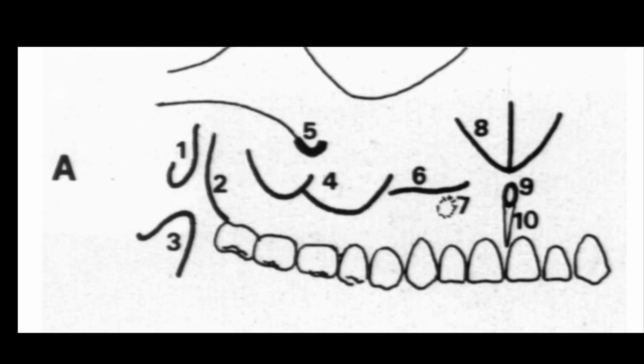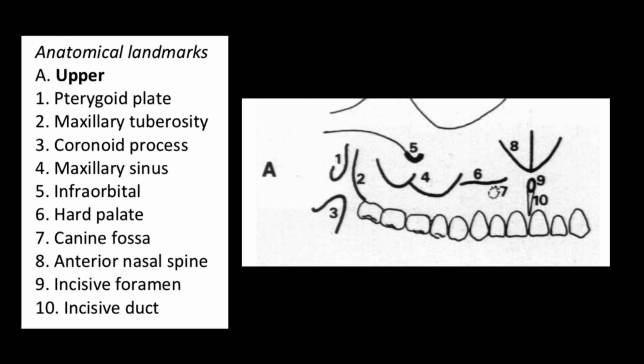That you really need to know, because this is not about the panoramic, this is about the anatomy that can show up in intraorals. So these sketches that are coming up are specifically for different anatomy that can actually reflect on a periapical intraoral X-ray on the maxilla and the mandible. And this you just need to know.